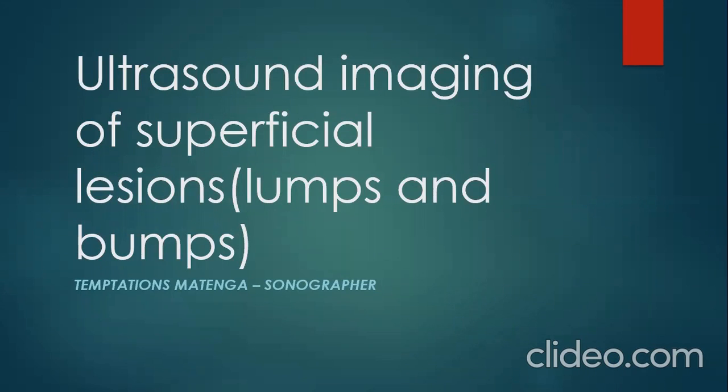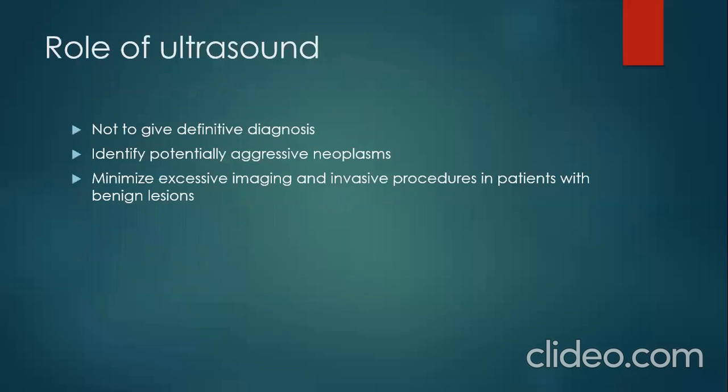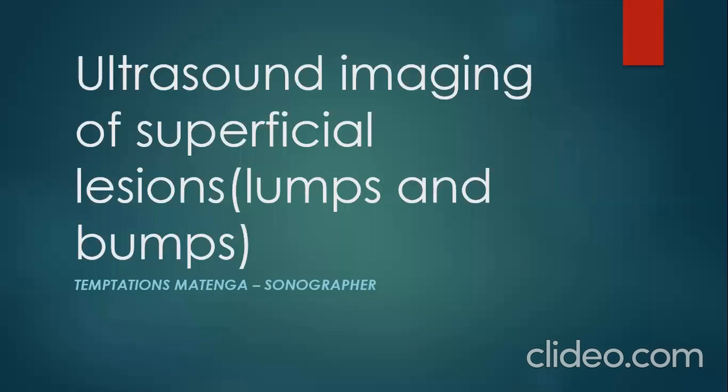How are you? My name is Temptations Matenga. I am a sonographer at United Flower Hospitals in Zimbabwe. So today we're going to talk about ultrasound imaging of superficial lesions, and to be specific, lumps and bumps.